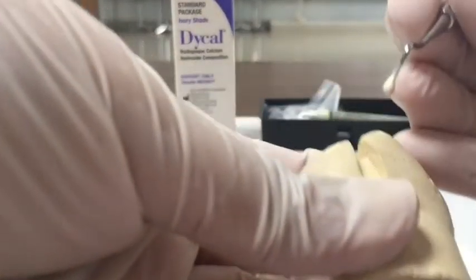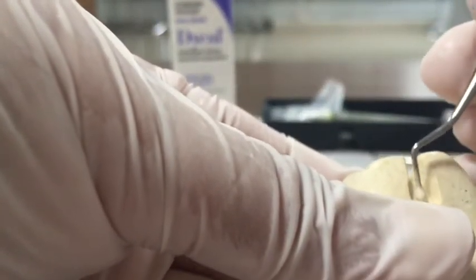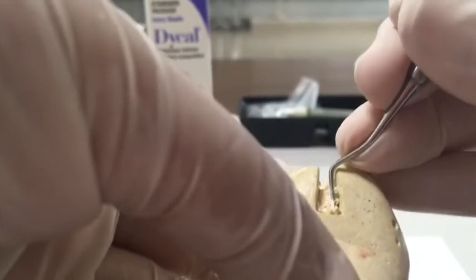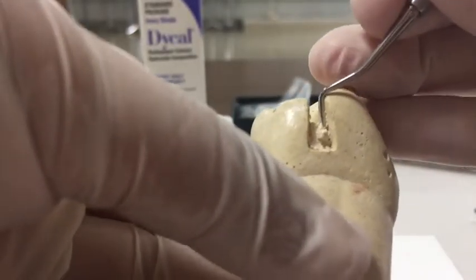Then we are going to take a blob of calcium hydroxide cement on the Dycal applicator and place it on the axial wall of our preparation. We will adapt it nicely along the surface of the axial wall in a thin layer of about 0.5 to 1 millimeter.